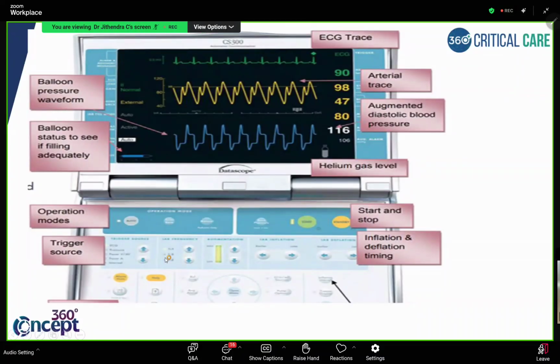And from the picture, that is also commonly asked. No need to get frightened when they say it is a question on IABP. Sometimes they keep it very simple, so not to worry much about it. They may not ask you about the timing or to interpret your waveform. They may just simply ask you, what is the augmentation in this particular picture? So what is augmentation? Anybody wants to tell? You can write it in your chat box.